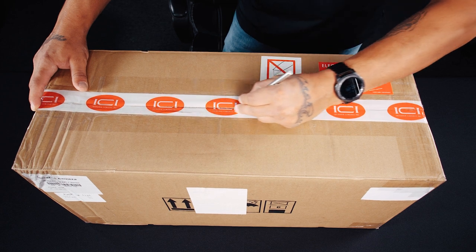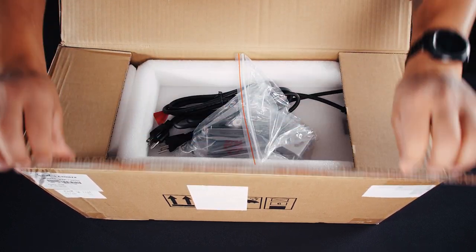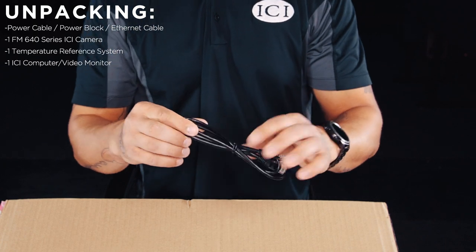Now we are going to carefully unpack your new ICI screening system. Ensure that when you cut the tape you don't cut too deep and cut one of the cables. First we have the power cable.